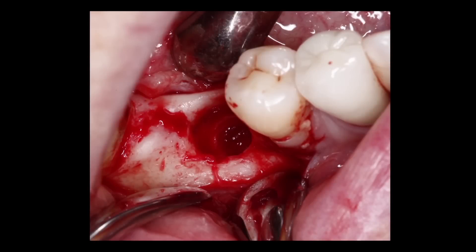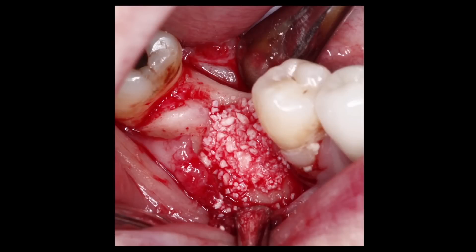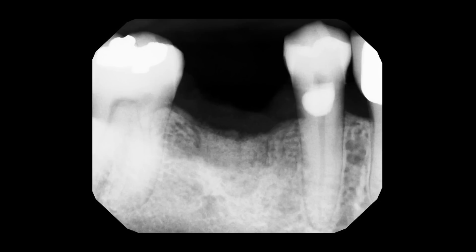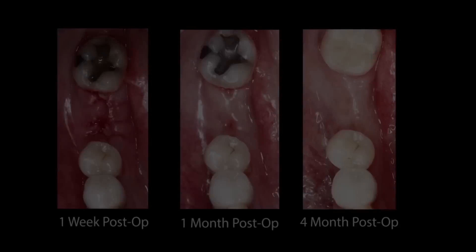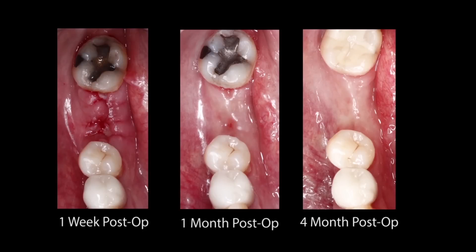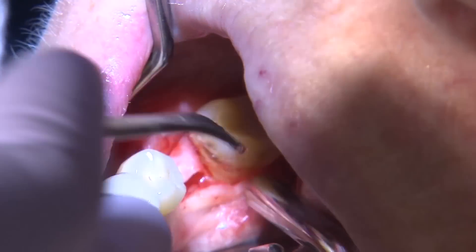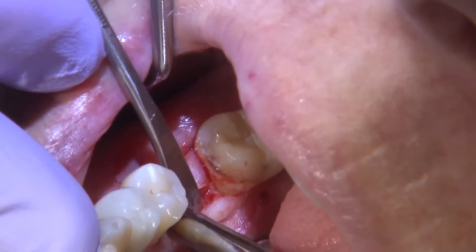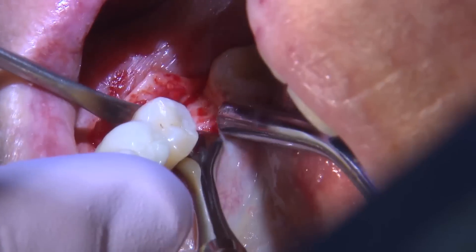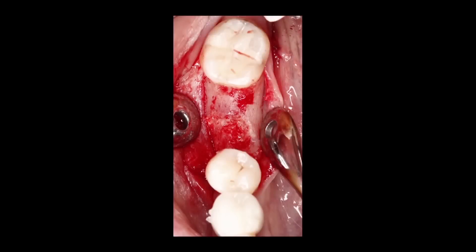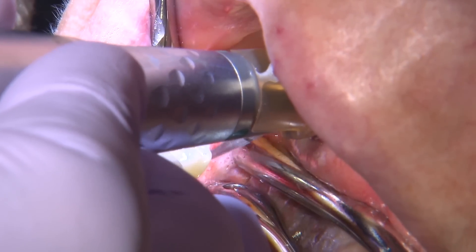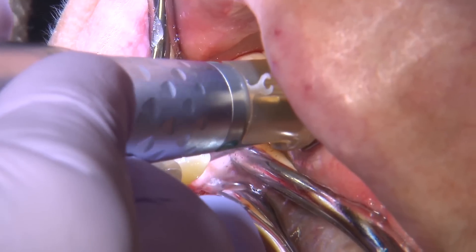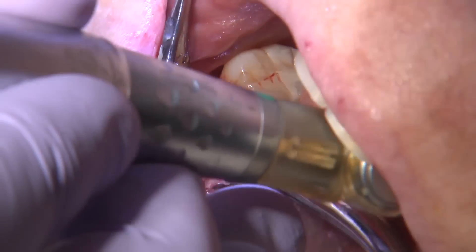Once the implant was removed, I opened a flap, placed bone graft material — in this situation, Bio-Oss — and let the patient heal for about four months. At the four-month period, you can see the progression of healing. I brought the patient back in for the implant placement visit, created a flap, and confirmed the bone had healed sufficiently to receive a new implant. I moved forward with creating the osteotomy, replacing the previous implant with the Han implant.